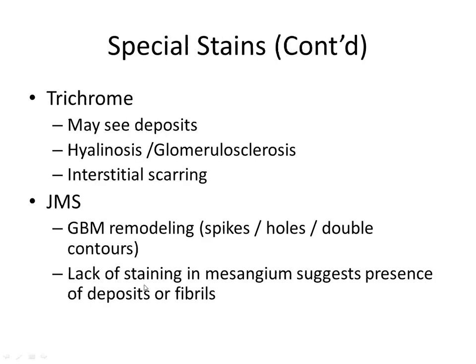The next special stains are the trichromes. The trichrome, and I think you can see in the JVM paper that I sent around, sometimes you're lucky enough to see the deposits on a trichrome stain, and they are red nodules. Usually, this would be in the setting of having a membranous pattern. So these red nodules are going to be on the abluminal surface, so away from the capillary lumen. And you should see regularly spaced small red nodules if you're going to make that diagnosis via histology. Occasionally, we'll see deposits that are actually subendothelial with the trichrome, but that's more of a rarity.